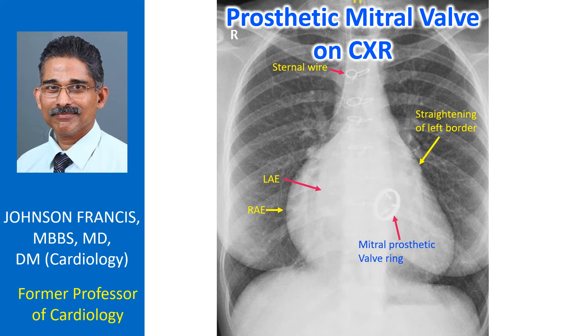X-ray chest taken after mitral valve replacement. Only the sewing ring of the tilting disc mitral prosthetic valve is visible. Three struts for holding the disc are also seen. The disc is not radiopaque and hence not visible.